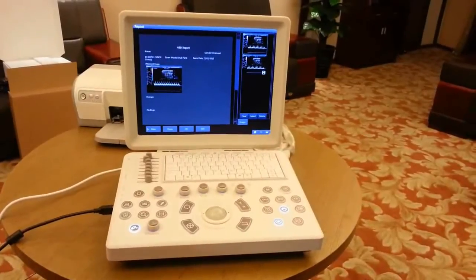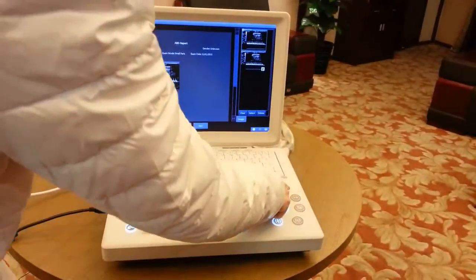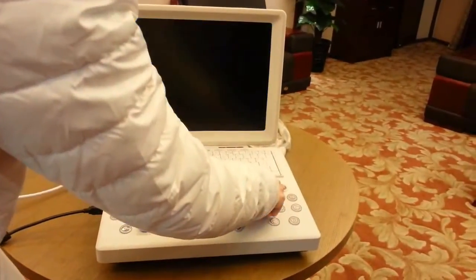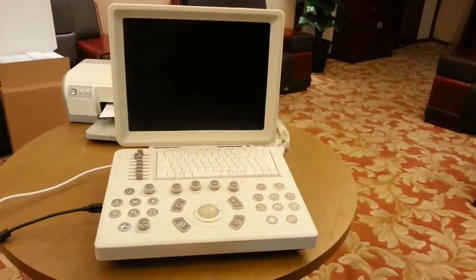Press the power button to turn off the machine.